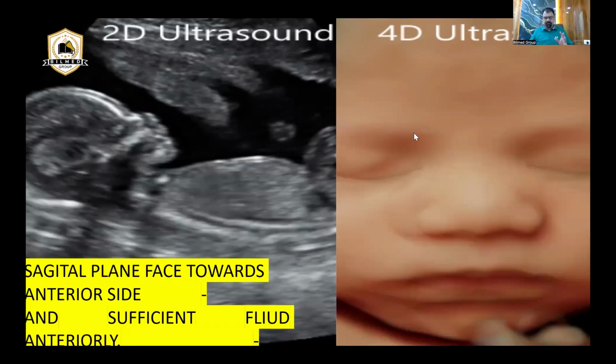When you are doing a 4D ultrasound, you are expecting clarity over there. You are expecting your 4D ultrasound to show you the fetal face, for example. 2D is the basis. It is the base of 4D. So the 2D ultrasound is the base of 4D. If you don't have a good 2D ultrasound slice, never ever you will be able to see the fetal face, in this case, if we are talking about the face.